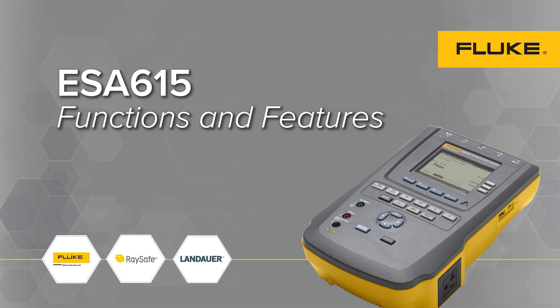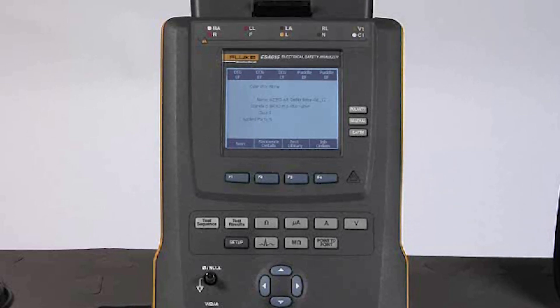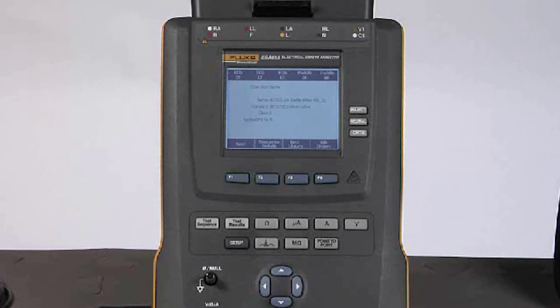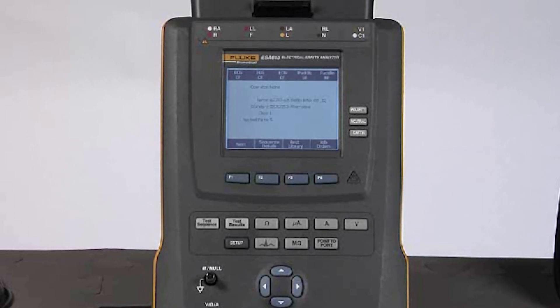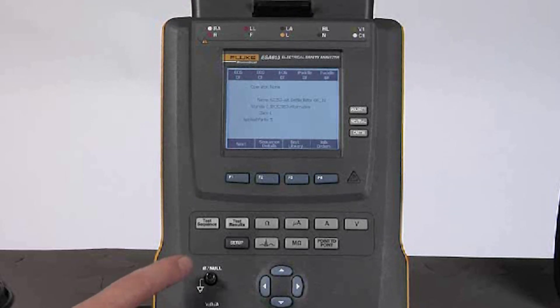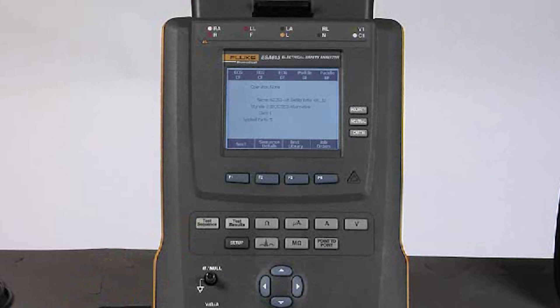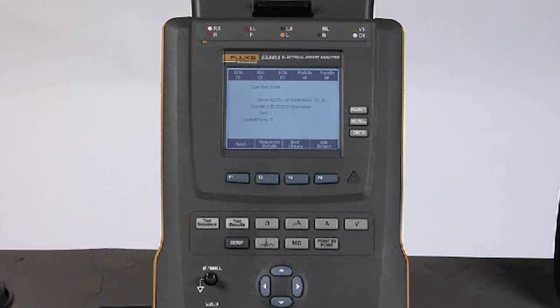Let's do a quick overview of the functions and features of the ESA 615 automated electrical safety analyzer. To begin with, the unit defaults to the last auto sequence that I have just completed. We would otherwise select the auto sequence button to get to the display you see on screen right now. If this test sequence is not the one that I want to run, I can easily select one from the test library.